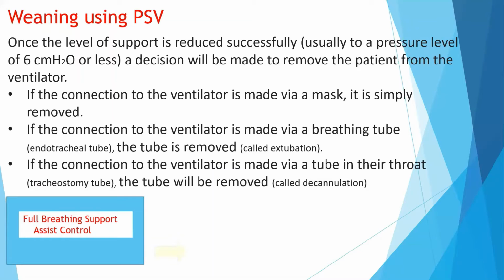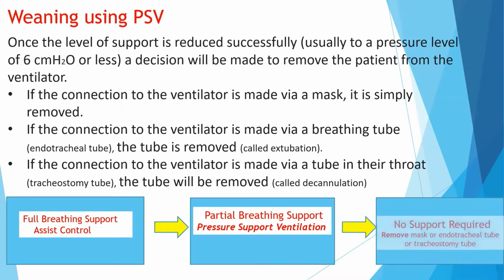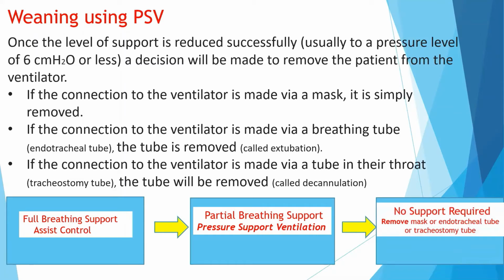Full breathing support, assist control. The patient then moves to partial breathing support, pressure support ventilation, and finally, the patient does not require any support at all. The mask, the endotracheal tube, or the tracheostomy tube is removed.